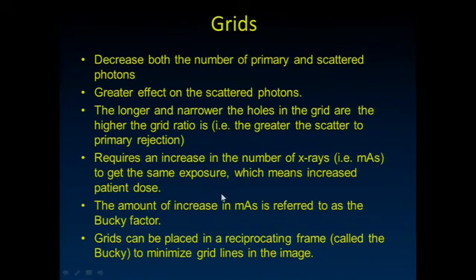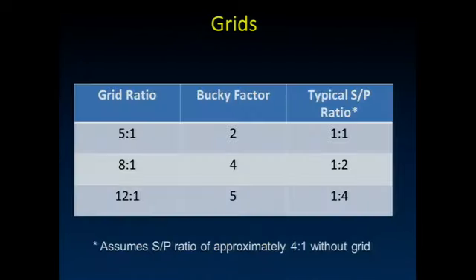We usually place the grids in a little bit of a reciprocating frame. They vibrate just a little bit, almost the diameter of the hole width is how much they vibrate back and forth, so that you don't see the pattern on the radiograph when you look at it.